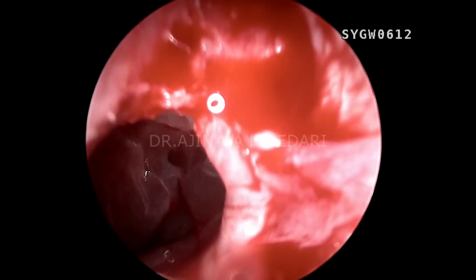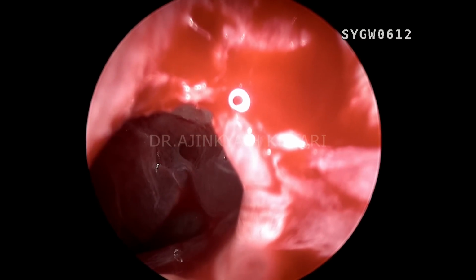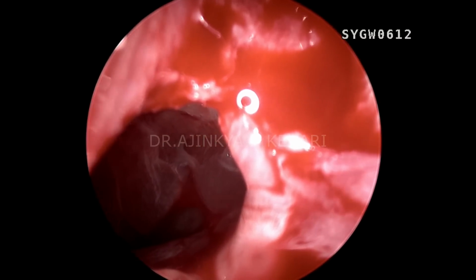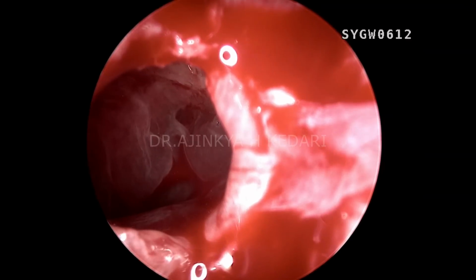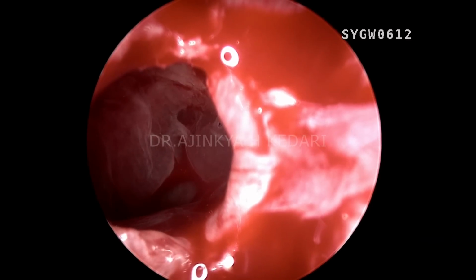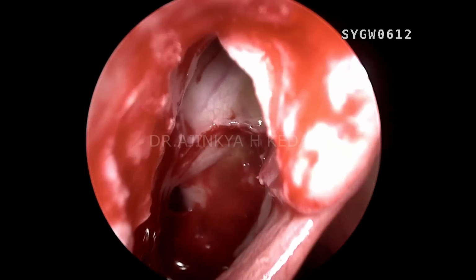Now, the reason I have opened up the sphenoid sinus is to check whether or not there's a third CSF leak site. So you can see there's no CSF leak happening in the sphenoid. It's completely clear. There are no pulsations as such. There's no fluorescein stained CSF in the sphenoid sinus.